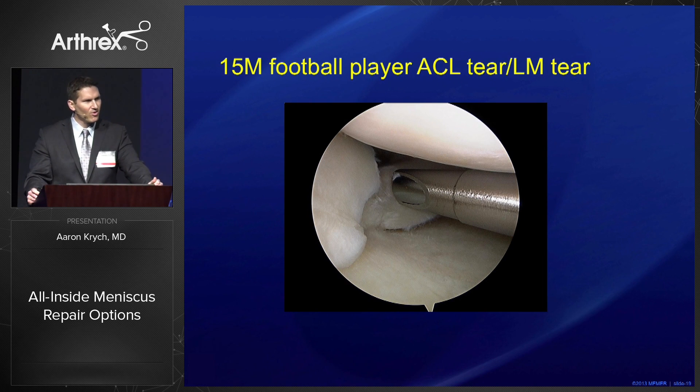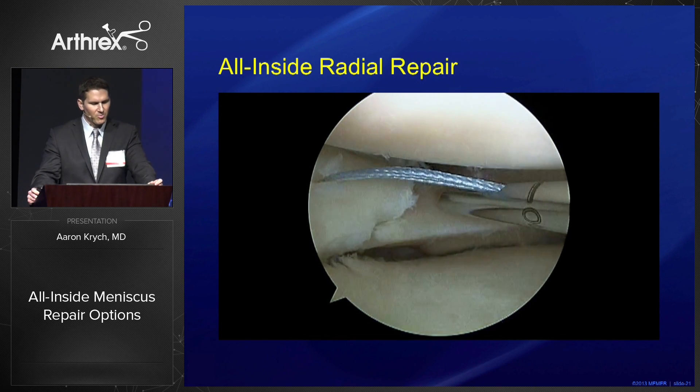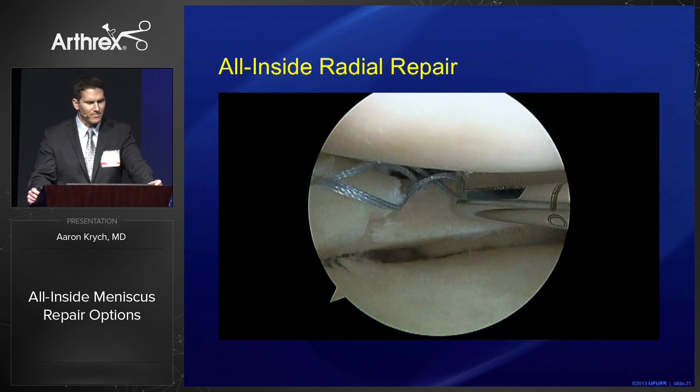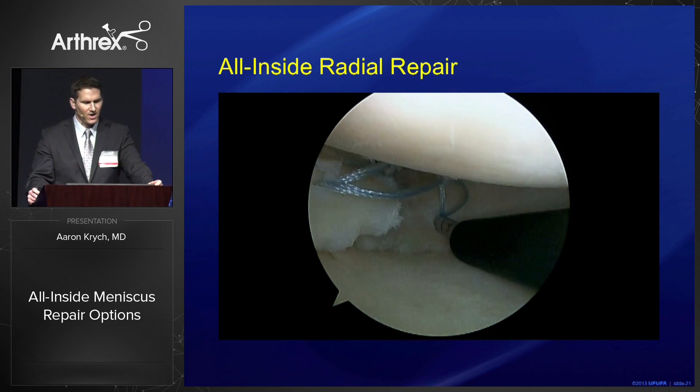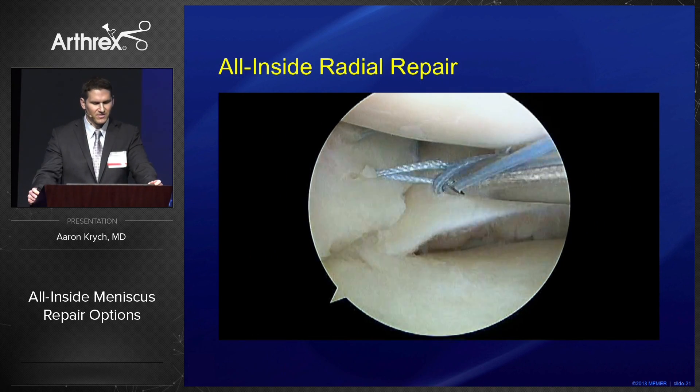Here's another case — a 15-year-old football player with an ACL tear and a full-thickness radial tear of the posterior horn of the lateral meniscus. These radial tears are sinister because as they go through the final 20 to 30 peripheral circumferential collagen fibers, we lose our hoop stress. When we lose our hoop stress, we lose meniscus function. Here we're performing a horizontal mattress suture for this full-thickness radial tear, and you can see the compression of the tear.